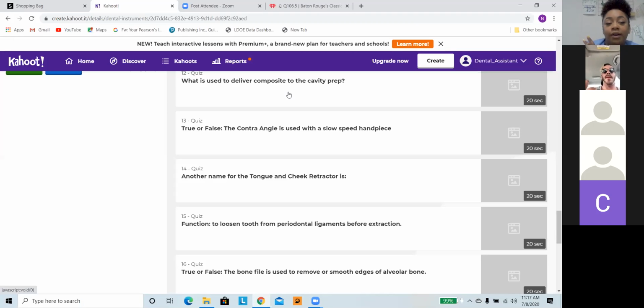Are you talking about the IRM from yesterday? Well, it's not so much an IRM. It's actually with your composite tray, you have, remember, a flowable composite and a packable one. It doesn't make sense to you just yet, but it will once you see the tray. But let's just see what option it gives us.